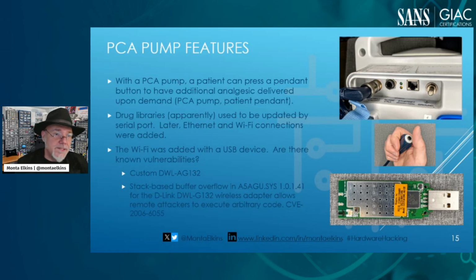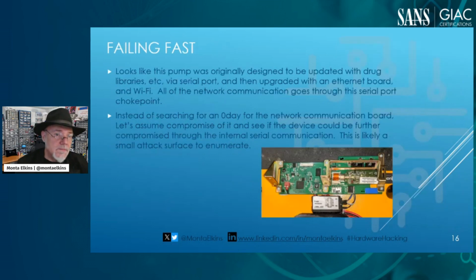So all these communication channels end up going through a serial connection to the actual pump. So there's a communication board, and then it goes through a serial connection to the actual pump hardware.